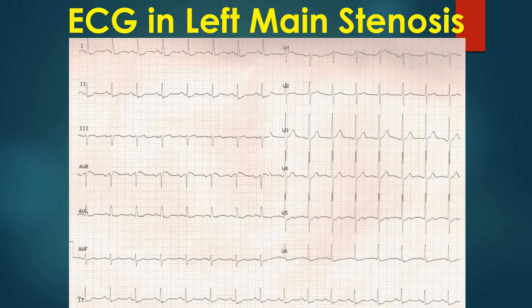A similar ECG pattern can also occur in severe proximal triple vessel disease. The previous ECG shown here for comparison shows minimal changes, with minimal ST segment elevation in AVR as well. This highlights the need for serial ECGs in acute coronary syndrome, as initial ECGs may be near normal even in those with severe disease.